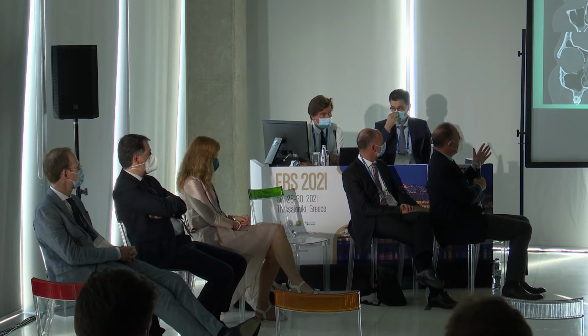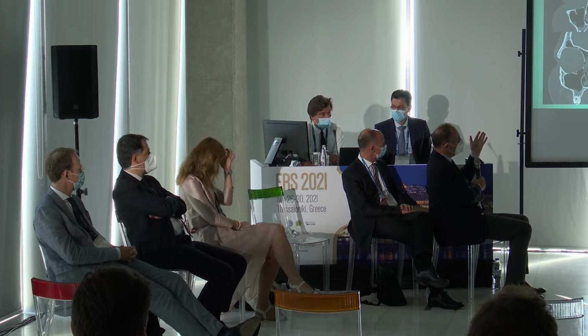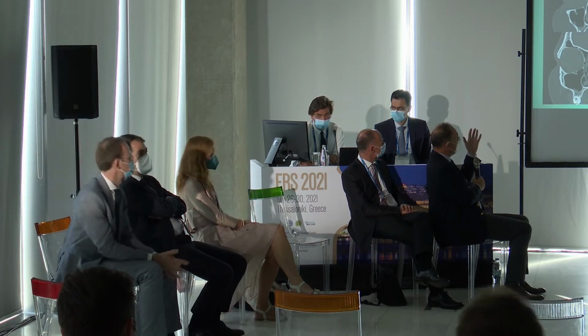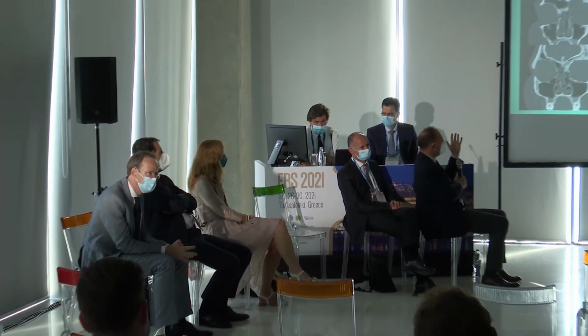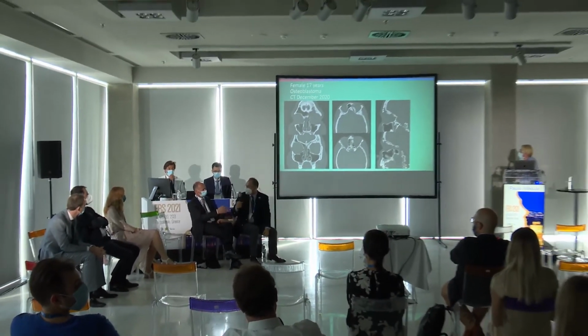And from that, I can also see the intraorbital fat and muscle, and between the mucocele and the fat, I can also appreciate if the osteoblastoma is growing or not. I don't know. These are my thoughts.